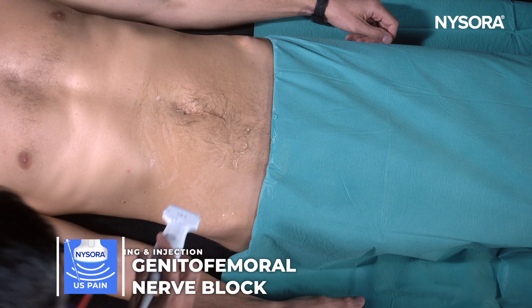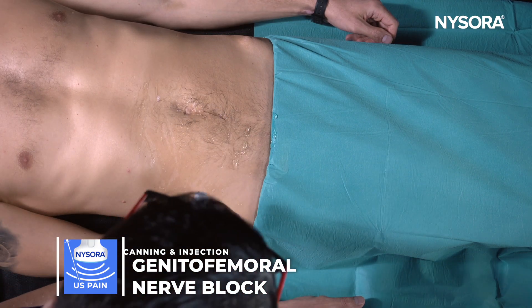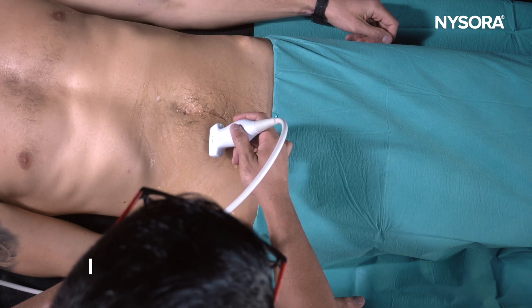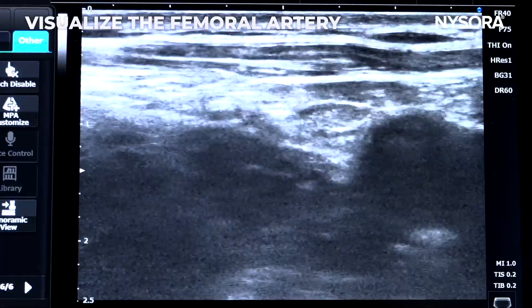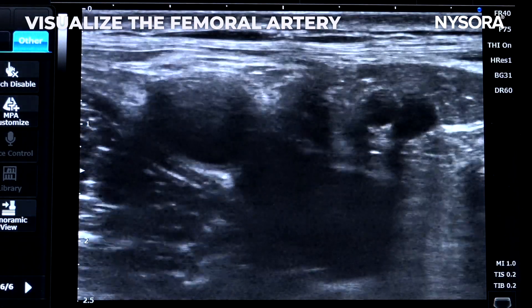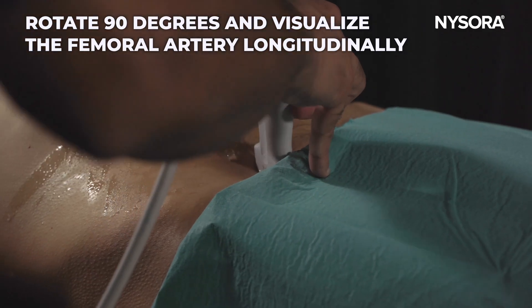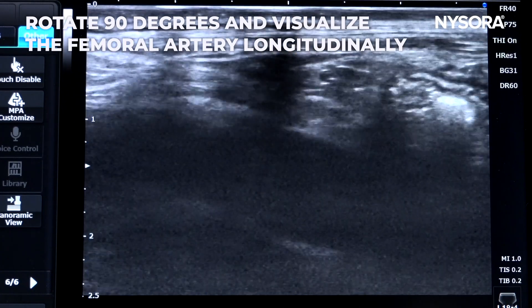To discuss the genitofemoral nerve block, there are two ways to scan the structure — from the top or from the bottom. Starting with the femoral artery, once you've begun scanning it, turn the ultrasound probe longitudinal to look for the femoral artery in the long axis.